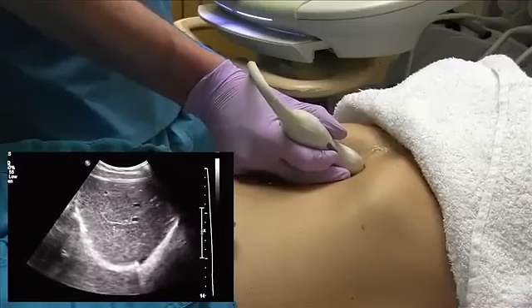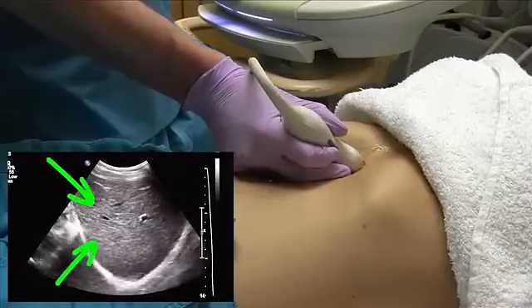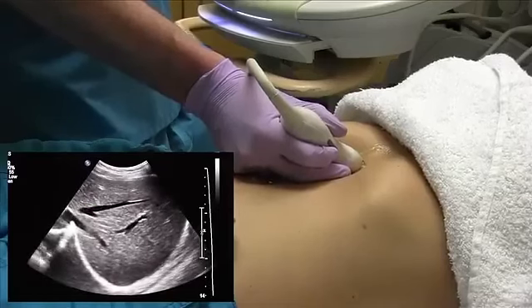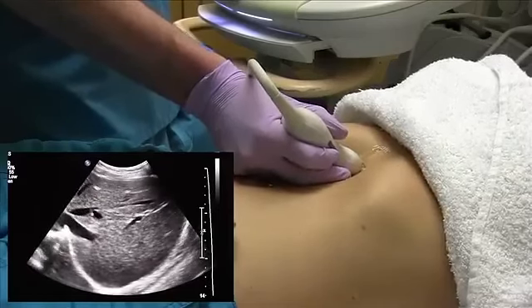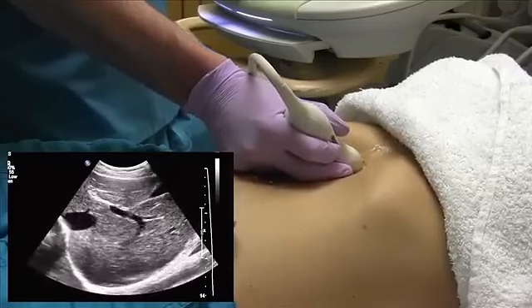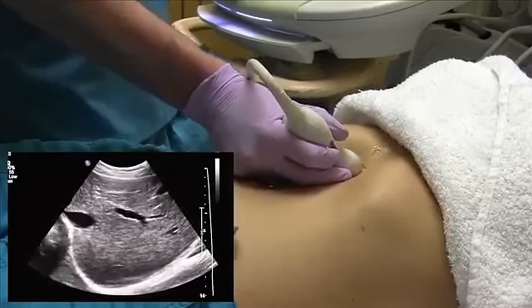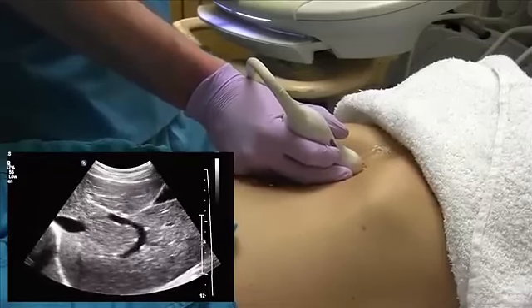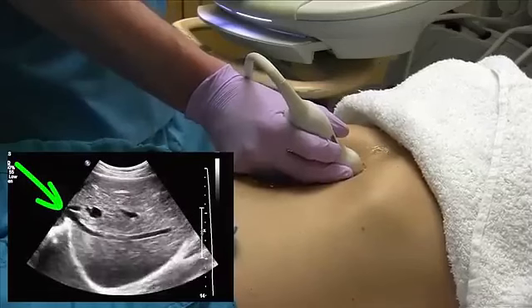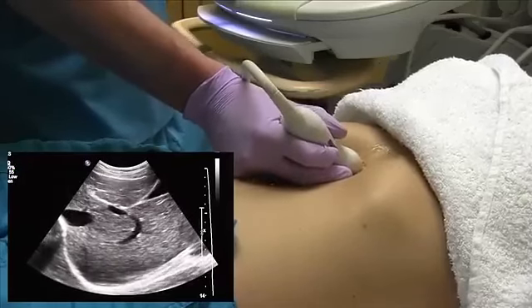And then as you come down, you're going to start to see the hepatic veins come into view. The walls of the hepatic veins are less echogenic than the portals, and that's usually a good tip-off that you're seeing the hepatic veins. Besides that, you can also see them obviously go directly into the IVC. And then that's my second picture of the right lobe.